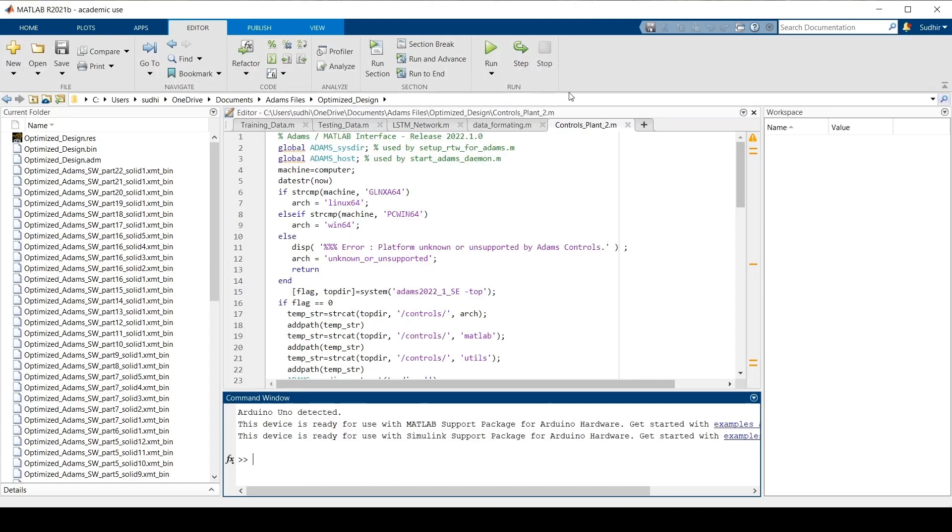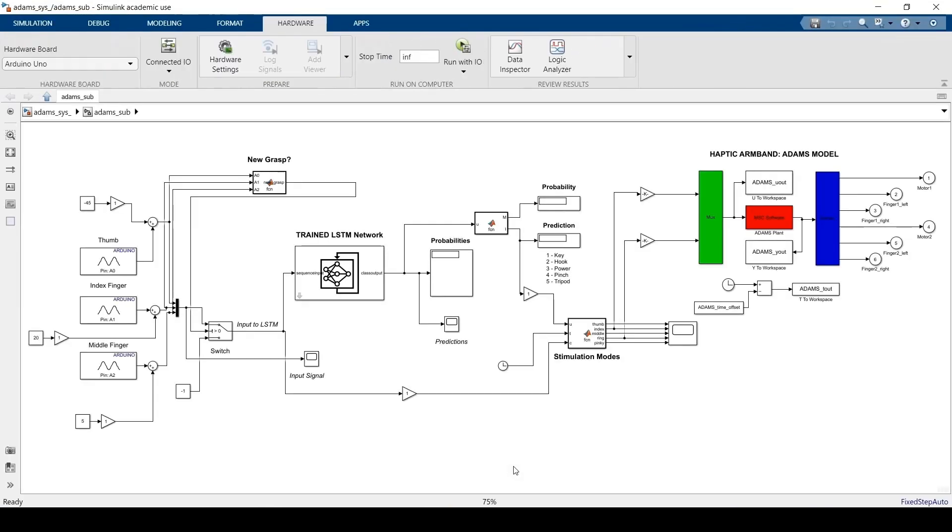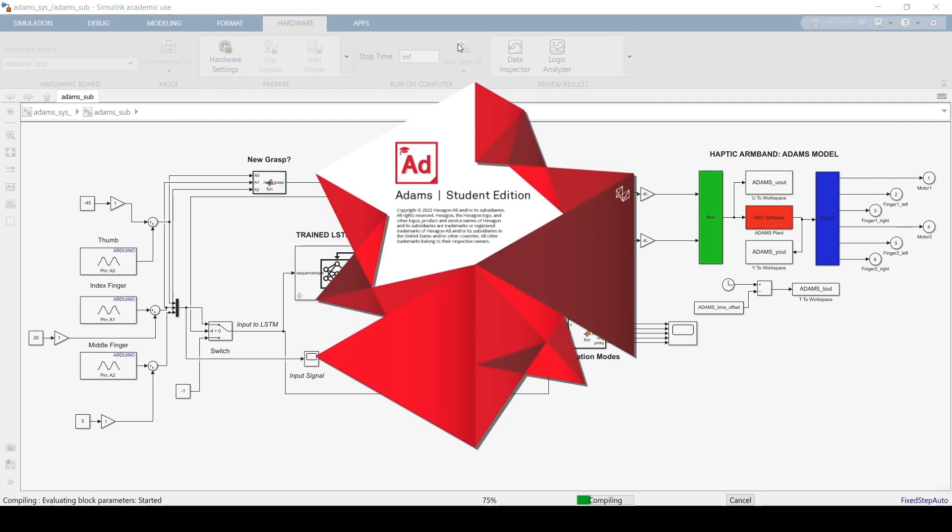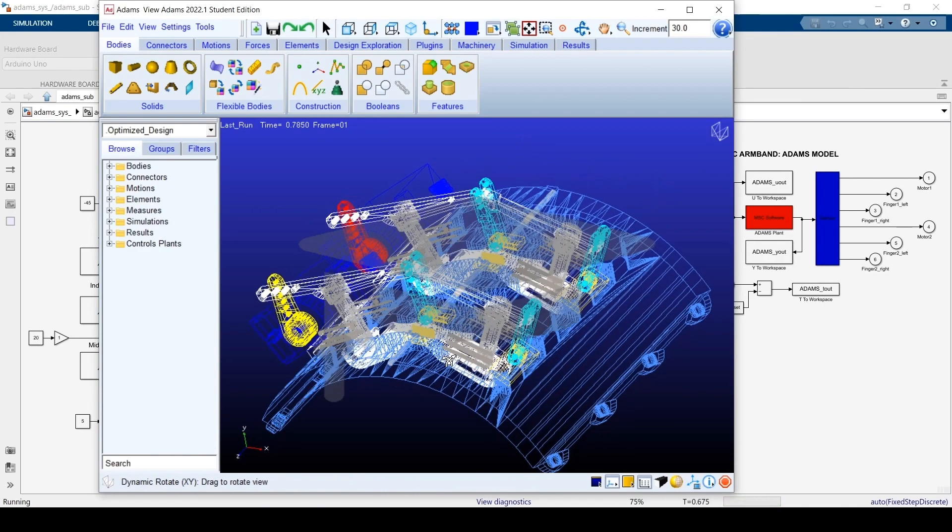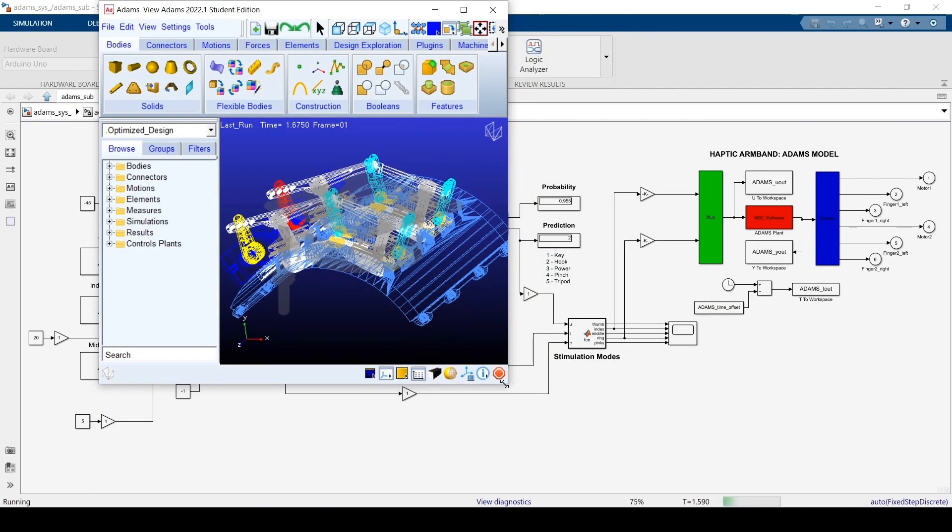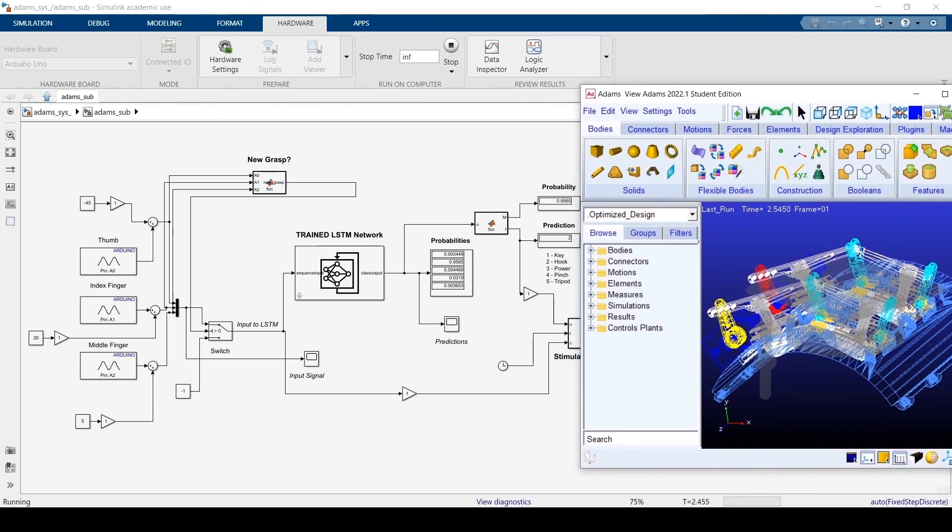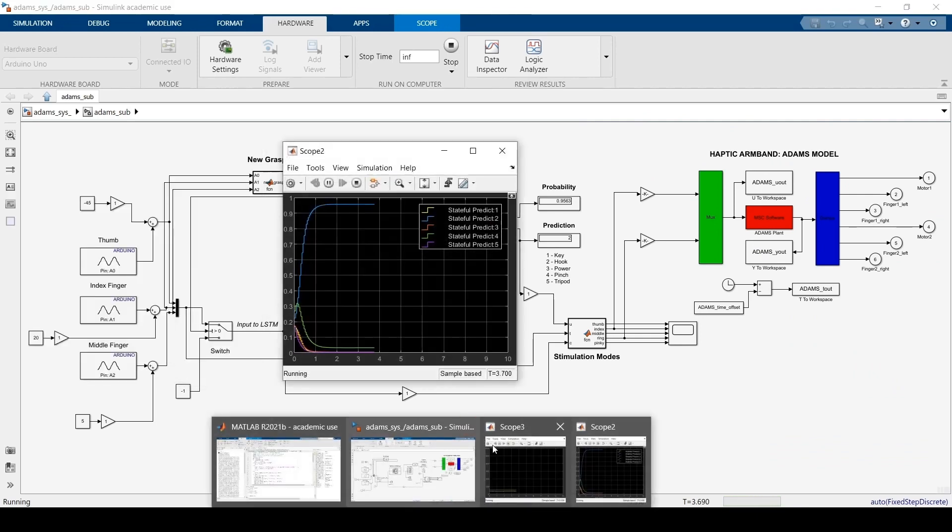Here I will now run the Simulink model so we can see. Once we start the simulation it will load up the Adams model and once the model is loaded the simulation begins. Here we can see that even though we are already making a prediction there is no output yet to the Adams model because we have not yet initiated a grasp.